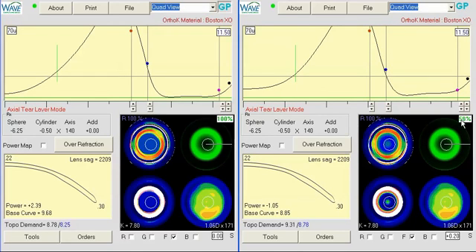So that's the only minor change I would make to the lenses that should push the optic zone back towards the edge of the pupil a little bit more and hopefully get your patient a little bit more comfortable at nighttime. So I think you're definitely on the right track. I'd say go for it and hopefully works well for your patient.